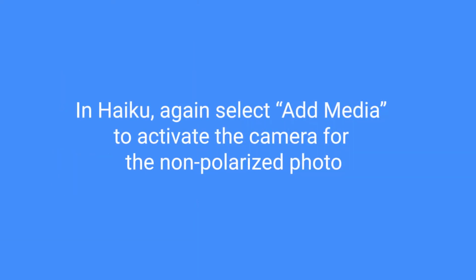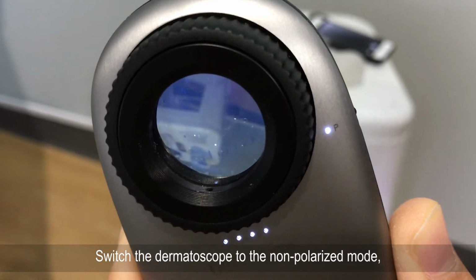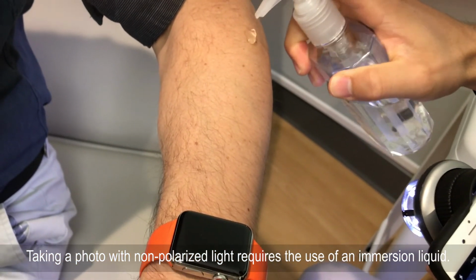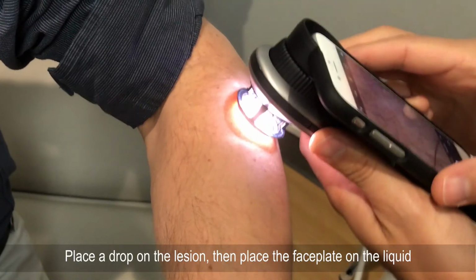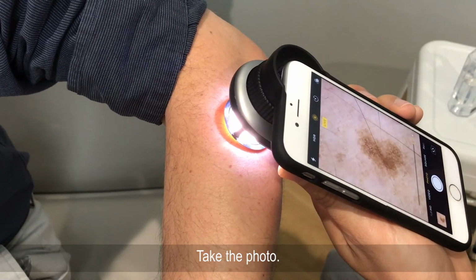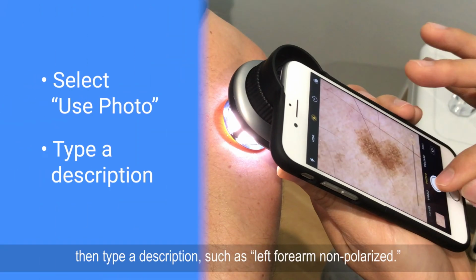In Haiku, again select Add Media to activate the camera for the non-polarized photo. Switch the dermatoscope to the non-polarized mode. The light next to the P should now be off. Taking a photo with non-polarized light requires the use of an immersion liquid. Mineral oil or alcohol-based hand sanitizer work well. Place a drop on the lesion, then place the faceplate on the liquid and the patient's skin, and magnify and focus as needed. Take the photo. If you are satisfied with the image, select Use Photo, then type a description such as left forearm, non-polarized.